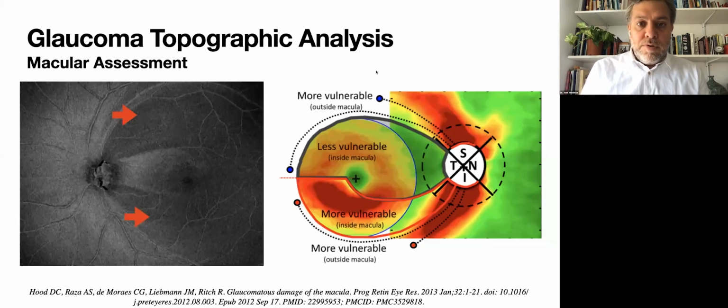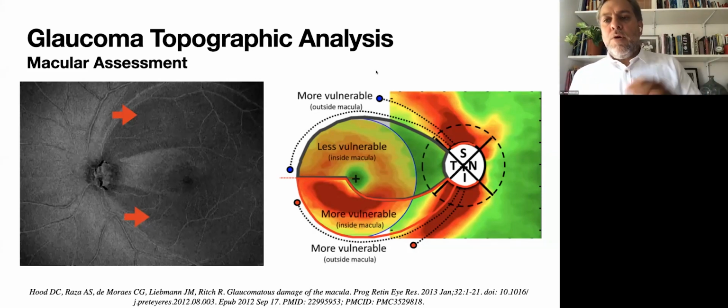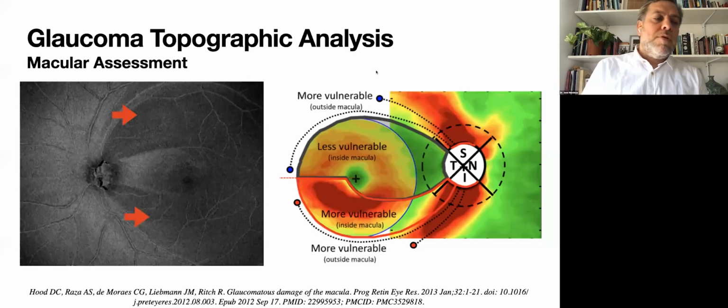Considering glaucoma diagnosis, which of the reports should we give more attention to between the HOOD report and visual field, especially when there are differences between them? You have to look at both of them. You have to look at the visual field, the HOOD report, and all the history and all the data that you have on the patient. The more information that you have, the more sure you'll be with your diagnosis.